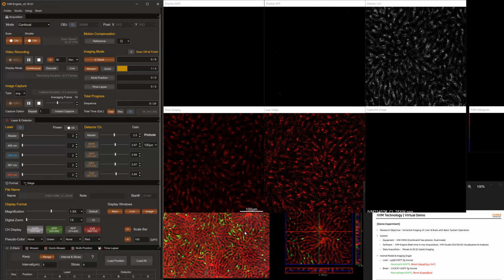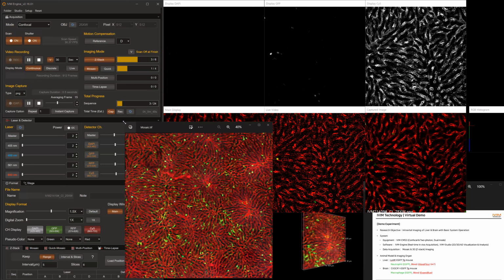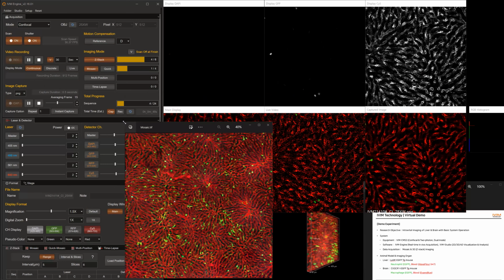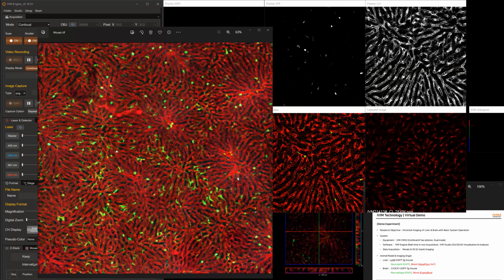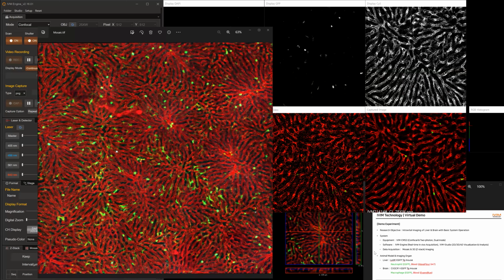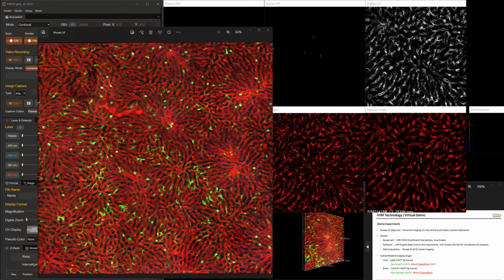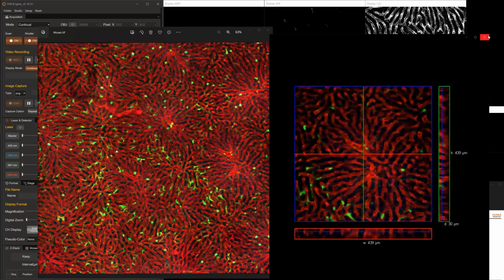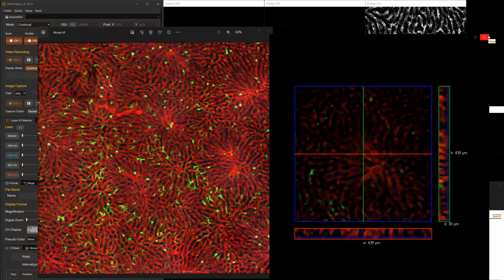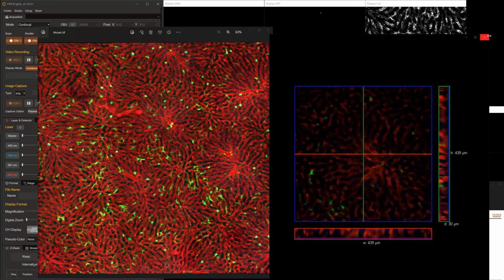During the image acquiring process of Z-stack and mosaic, I'd like to share the imaging data that has already been taken this morning. Every experimental condition is the same. On the left side of the screen, 3 by 3 mosaic images in the width and length of the liver. On the right side, there comes the extracted video of the 3D built data. Look how beautiful the in vivo liver imaging we could get from a live mouse.